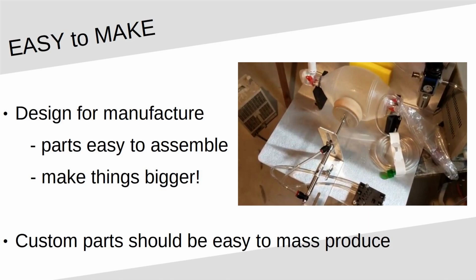And one consideration is, how do you put the parts that you've designed together? It should be fairly easy. You shouldn't have to try and, with great effort, put a screw in somewhere that is blocked by every other part of the device and so forth. You can often do this just by making something bigger than you otherwise would.